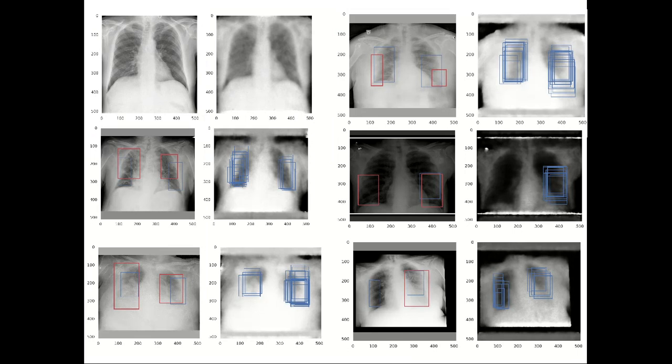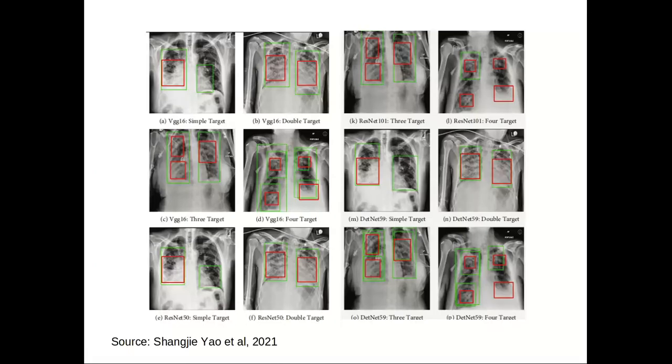This task of pneumonia opacities detection and localization in chest X-ray is actually a pretty hard one. Various reports show that even when the heavy weapons, the state-of-the-art deep models, are taken as the base neural networks, the results are still generally not good enough. You can see some examples of that on the slide.